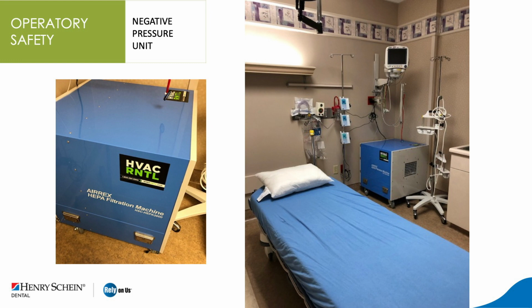Now, let's move on to the topic of negative pressure units for just a minute. There's been increasing interest in the use of negative pressure rooms in dental offices. Traditionally, these rooms are in hospital emergency rooms. Most of those emergency centers are equipped with one or two negative pressure rooms that are actually built into the hospital mechanical system.